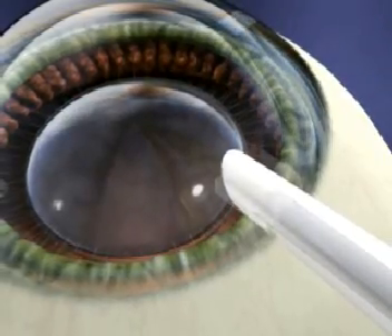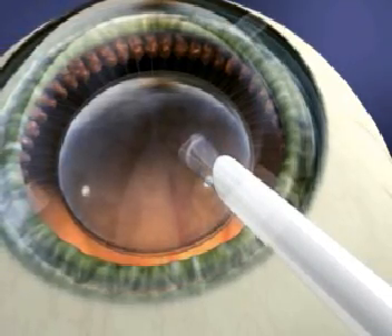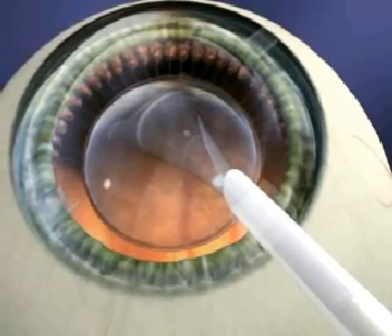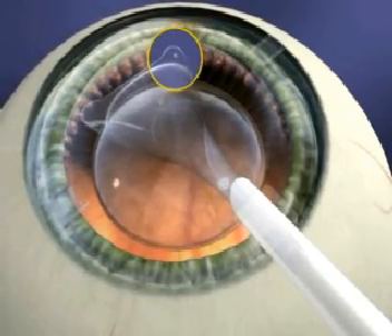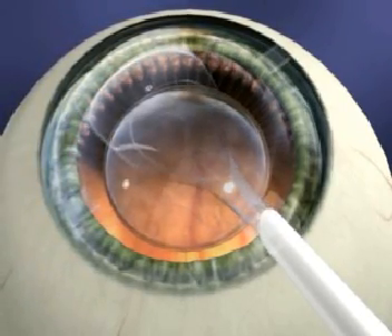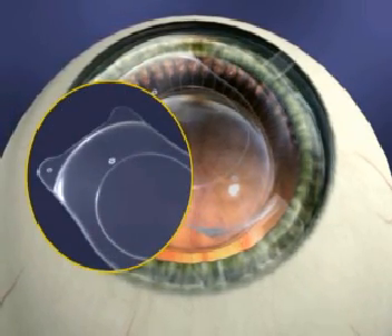You are now ready to inject the ICL. Place the tip of the cartridge, with the bevel down, just inside the incision. Slowly inject the ICL using a tapping motion until the leading right landmark is visible. The ICL will unfold in a slow and controlled manner. Do not fully inject the ICL until you see the landmarks. Remember, as long as the ICL remains within the cartridge, you still have control of the implantation process. Be patient.